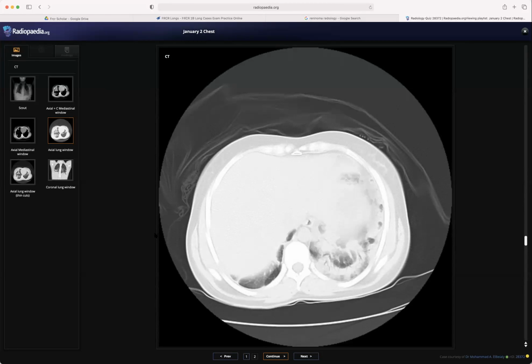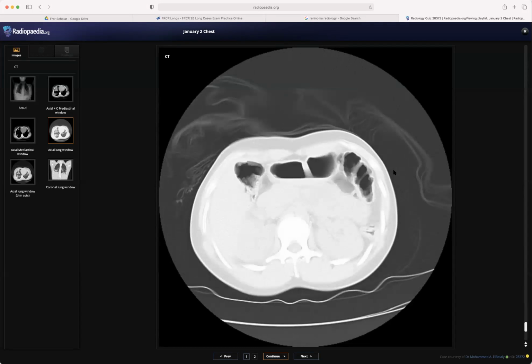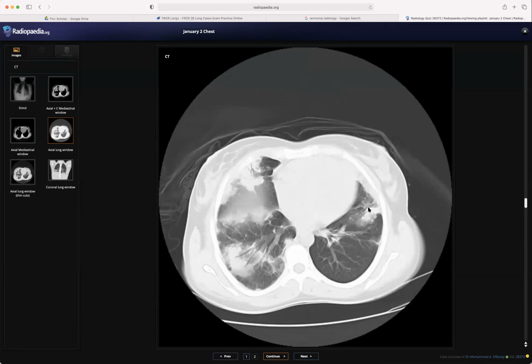Very well. So you can summarize, because the next candidate also has to get the time, and give the feedback. Okay, fine. In summary, this case was a cryptogenic organizing pneumonia. The basic differential here for the reversed batwing appearance is mainly infections like COVID and atypical pneumonias, cryptogenic organizing pneumonia and chronic eosinophilic pneumonia. So we'll just have to put this differential and work out how to exclude each one of them, if possible.